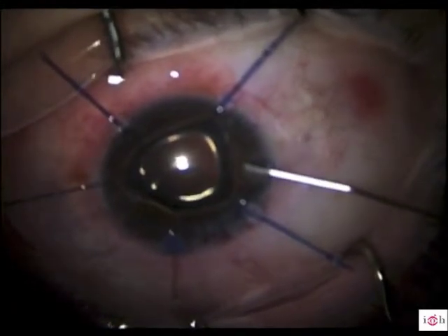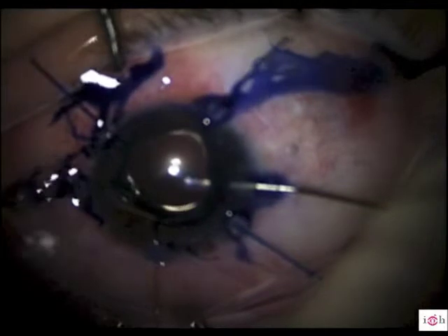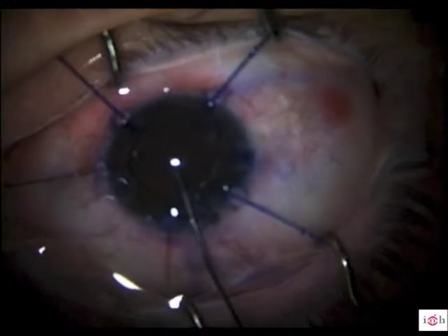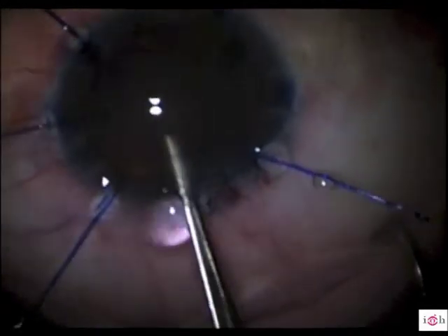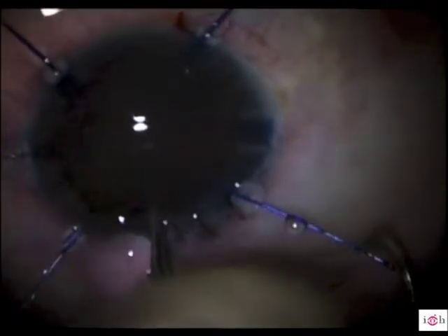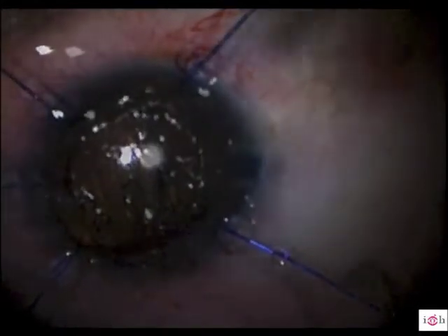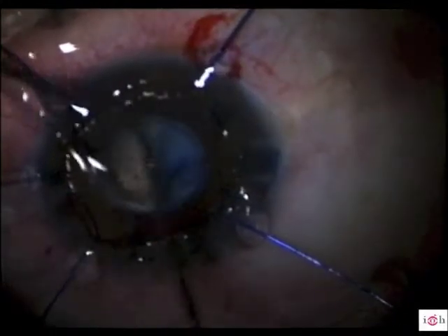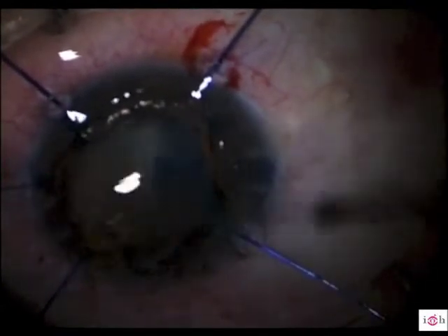Then we injected air and trypan blue for 1 minute to dye the anterior capsule. We injected viscoelastic and performed the capsulorhexis with forceps. Because of the great loss of corneal transparency, it was very difficult to continue with the surgery. We decided to remove the corneal epithelium and put visco on the cornea. This was the key to completing the capsulorhexis successfully.